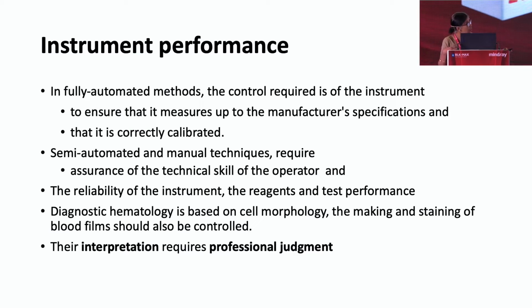So, in fully automated equipments, control is required of the equipment to ensure that it measures up to the manufacturer's specifications and that it's correctly calibrated. There are, however, smaller labs which use semi-automated equipments where assurance of technical skill of the operator, the reliability of the reagent and the test performance are equally important.